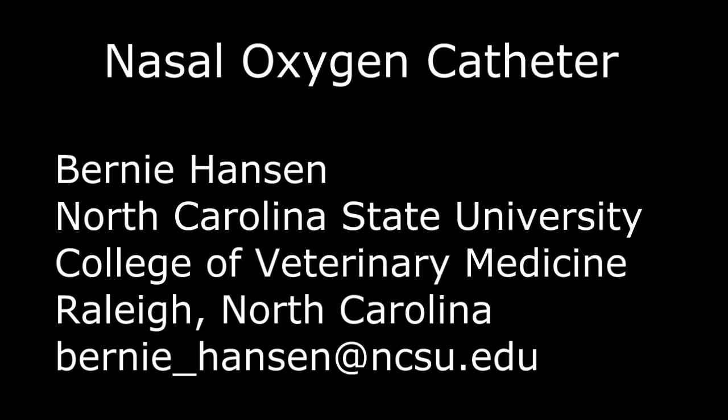Hi, this is Bernie Hansen at North Carolina State University. In this video I'm going to demonstrate placement of a nasal oxygen catheter.